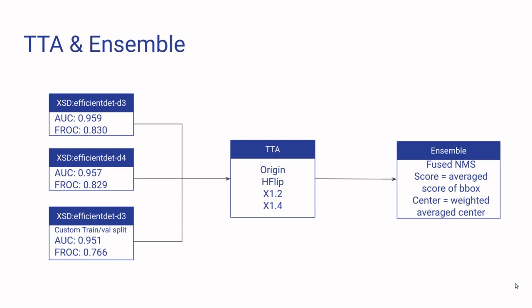And the third one is the same architecture as the first one, but I trained it with a different train and validation split, which means I put the validation dataset in the training and took the same amount of images from training as the validation.